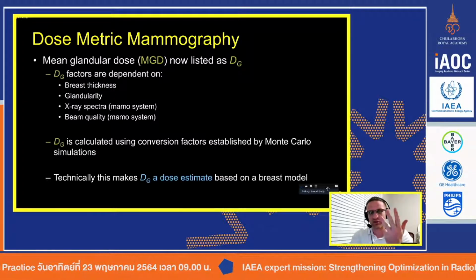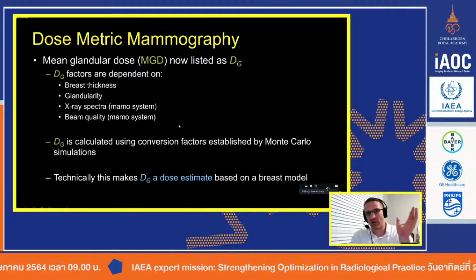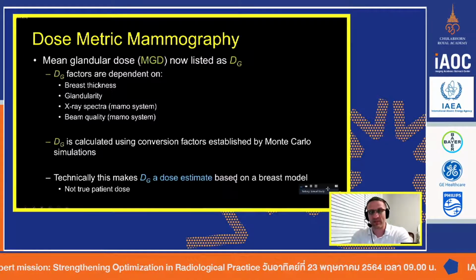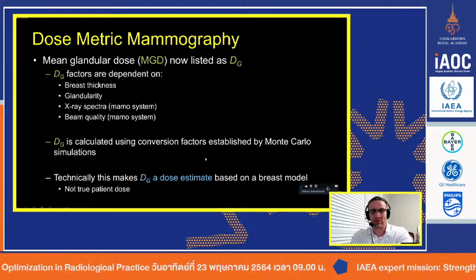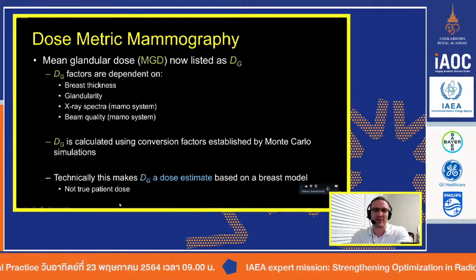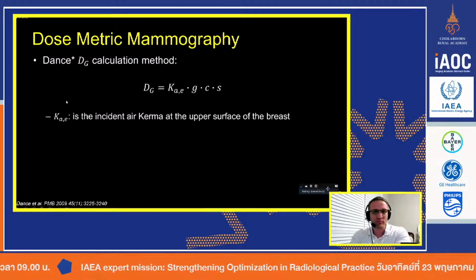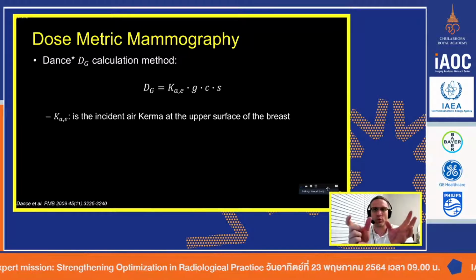So you would assume that there would be no patient-specific dose in mammography. So we always talk about patient dose, but we actually don't know the specific dose. We can get real good estimates, and there's no reason why those estimates shouldn't be applicable to patient populations. But when Jane walks in and someone gets their mammogram, we don't actually specifically know what the dose is to that breast.